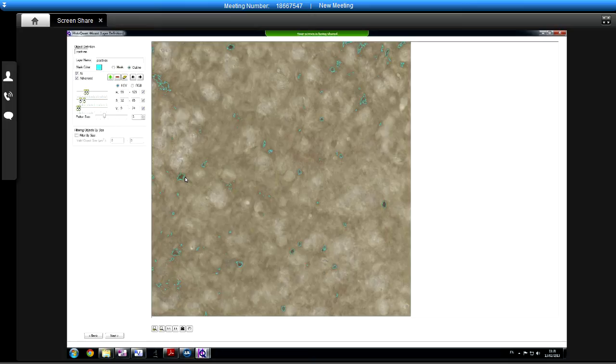So what we might find is if we just click back here, it won't forget what we've done on that screen, and maybe just put the smoothing filter up quite a lot. When we go back to here, you see some of them a bit smoother. Or what we might find is if we go back to here and try the other filter, and then go forward. Okay, it's not making a massive amount of difference in this case. Some of them are a little bit rounder. Okay, so all we've seen there is that frame-based filters in this particular sample is not making a massive amount of difference.